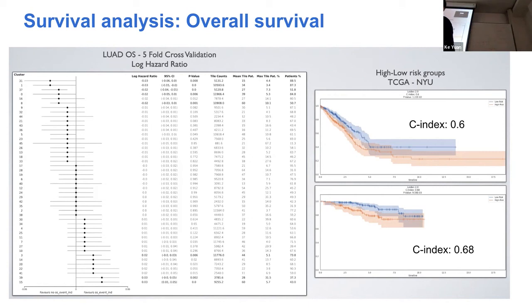of course you can also visually inspect and also use other information. I will get to that. Don't you think this is a tedious job? Visual inspection. But you also have other statistics helping you. For example, for each cluster, you have the percentage of patients contributing tiles into it.